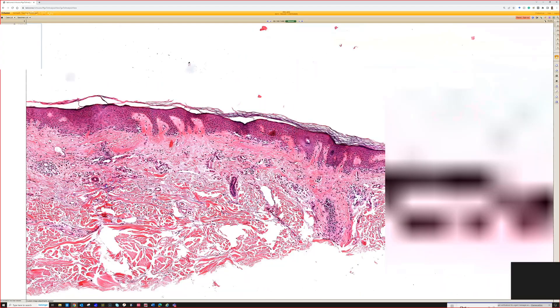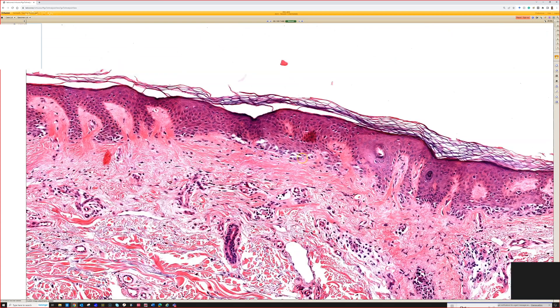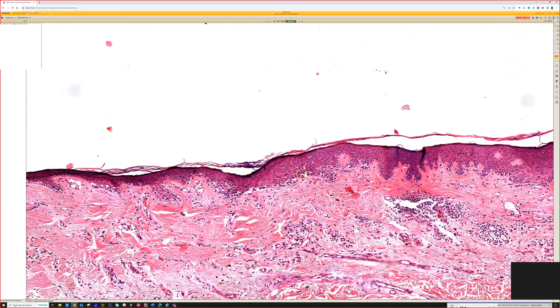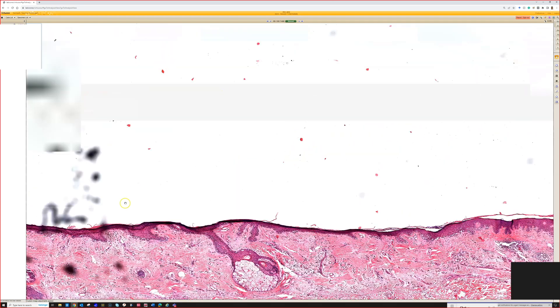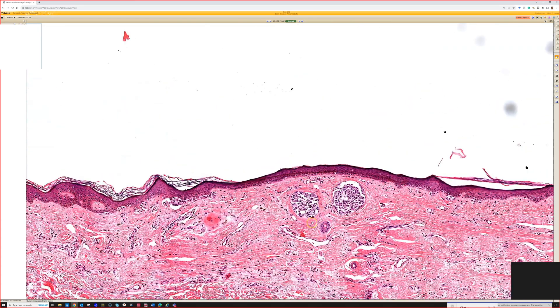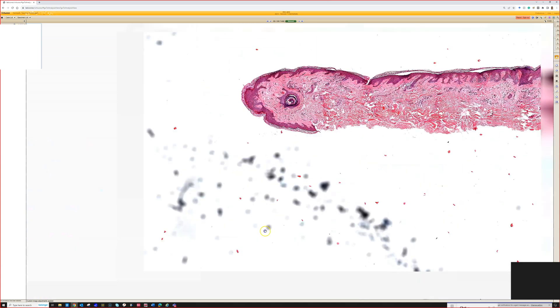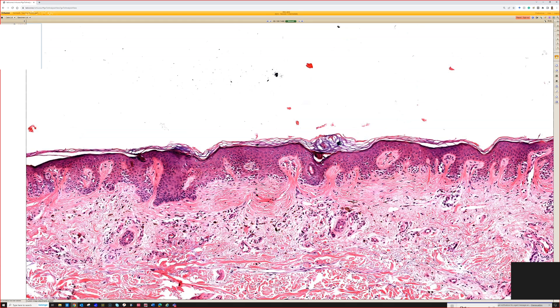Out at the edge it looks a lot like a dysplastic nevus — a good reminder that melanomas can have bridging and fibroplasia with features resembling dysplastic nevus. But here we have atypia, pagetoid spread, confluence, and atypical nests in the dermis embedded within the regression. Sometimes when most of the lesion has regressed away it's difficult or impossible to be sure if it was melanoma — look at how much that edge looks like dysplastic nevus. Scary.